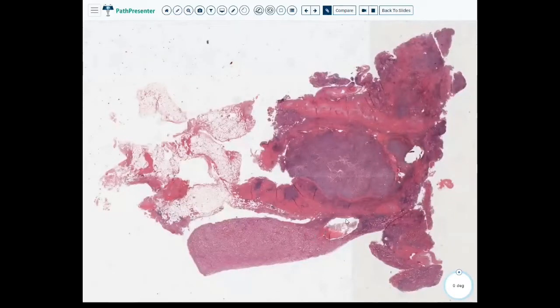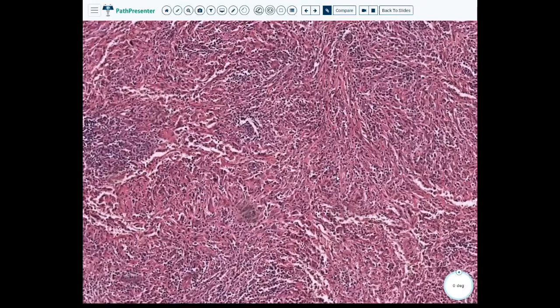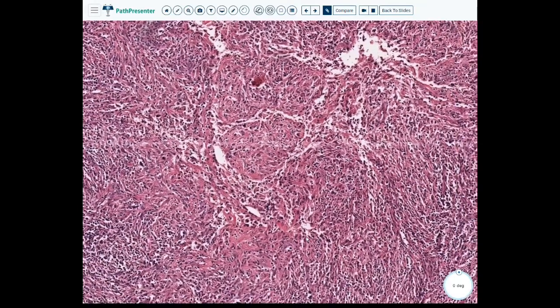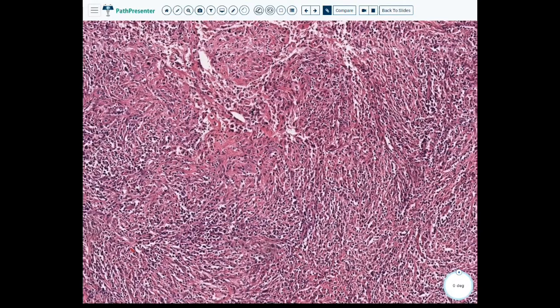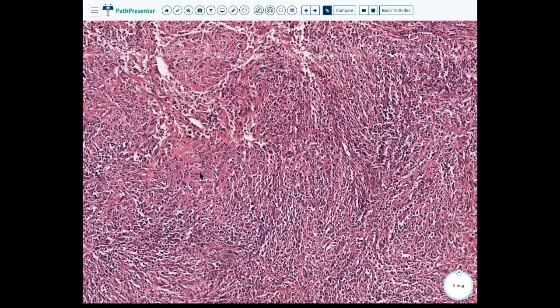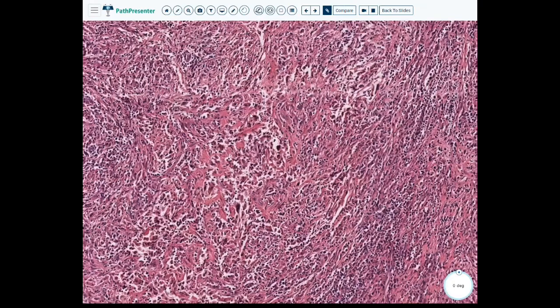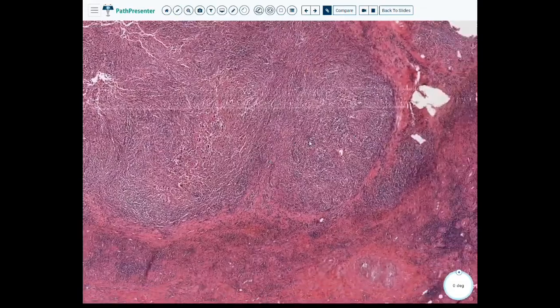So this case, this looks like this is our lesion, maybe something up here. Those look like gloms. We have fat, and this looks like this is probably normal renal parenchyma down here. So let's just go right for this. And at first, maybe it doesn't seem like too much. We have a lot of chronic inflammation in the background. There are some histiocytes, okay? They're kind of sprinkled throughout. And a lot of collagen deposition. We see this collagen deposition. So maybe this is something that's been here for quite a while.